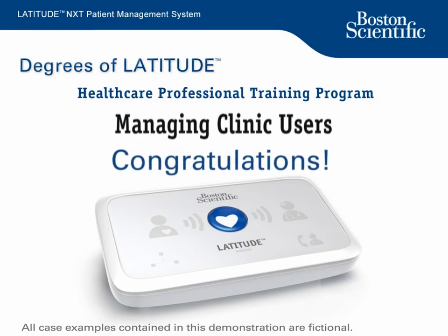Congratulations! You successfully completed the Degrees of Latitude module on managing clinic users in LATITUDE NXT.